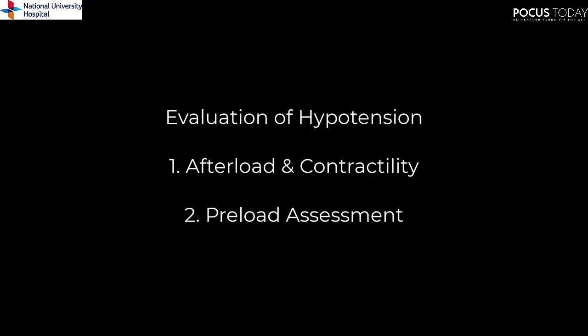In Part 1 of the Salvation Protocol, we looked at evaluation of contractility when making an echo assessment of the hypotensive patient. In Part 2, we have looked at afterload and preload assessment. Part 3 of the Salvation Protocol will look at the lung views used in evaluation of hypoxia.